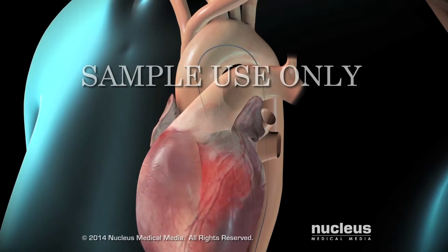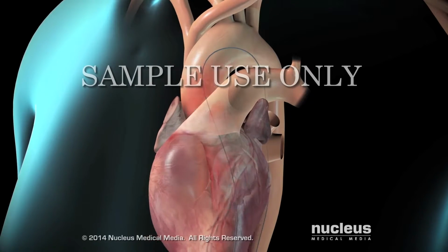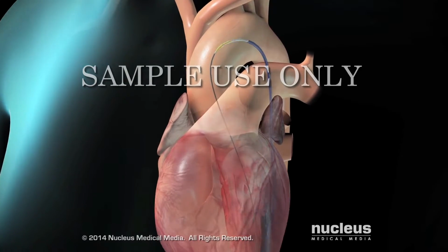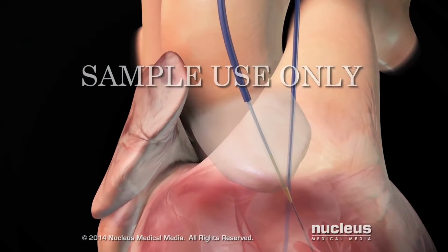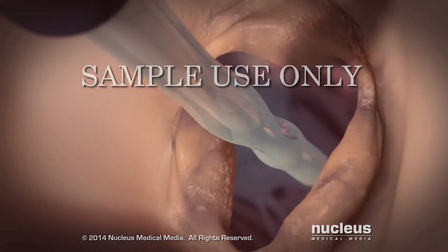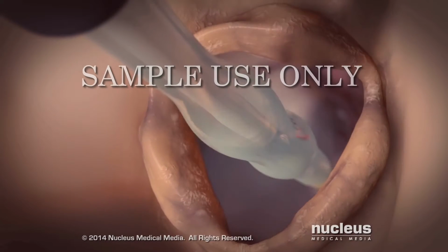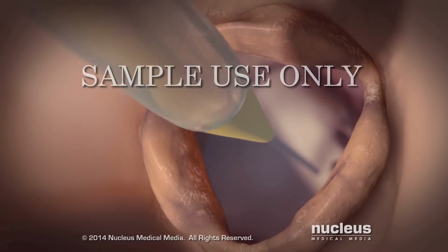Then, the guide wire will be pushed through the opening in your aortic valve and into your left ventricle. Your doctor will use the guide wire to pass a flexible tube, called a catheter, through your aortic valve. A balloon on the tip of the catheter will be inflated to widen the opening in your aortic valve and push the valve leaflets to the sides. After deflating the balloon, your doctor will remove the catheter.